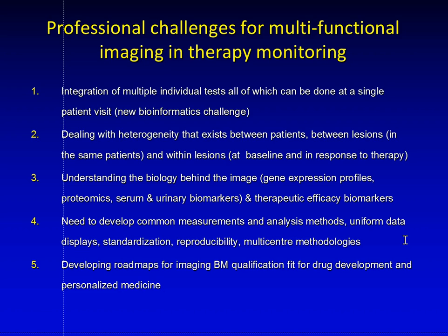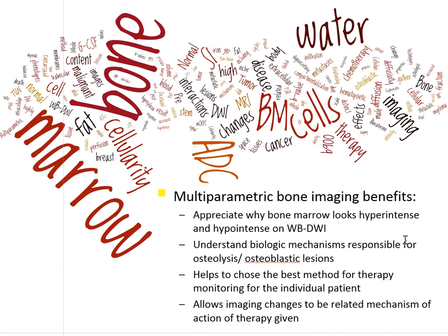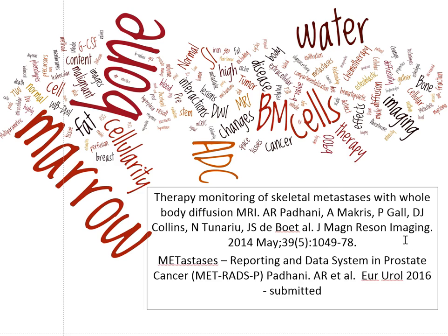And in this regard, there are new developments that are occurring, and these new developments include the new METRADS-P reporting system for whole body MRI scan, which has been submitted to European Urology and will be available online soon. So I'm going to stop there, if I may, and I'd be happy to take any questions.